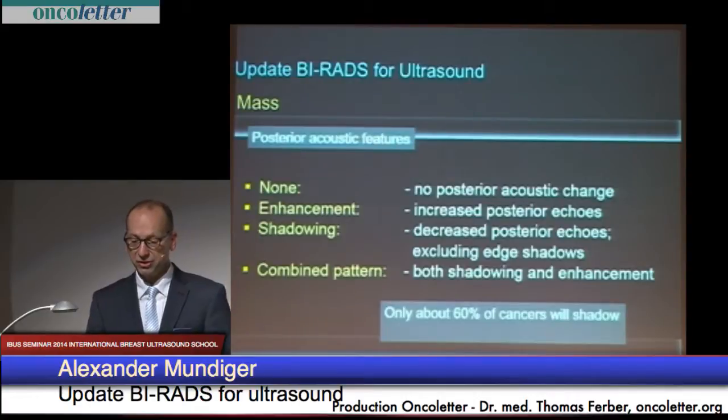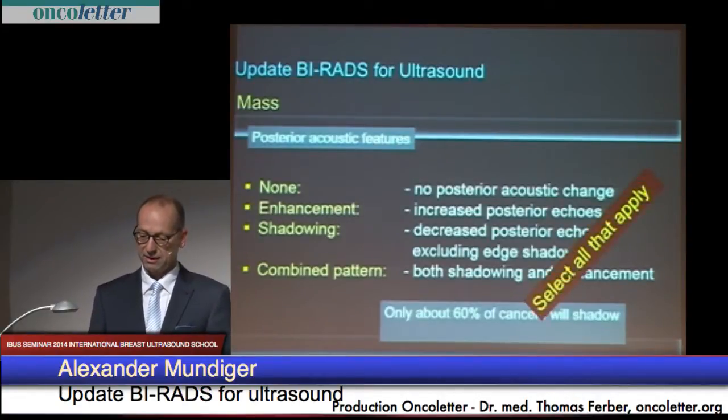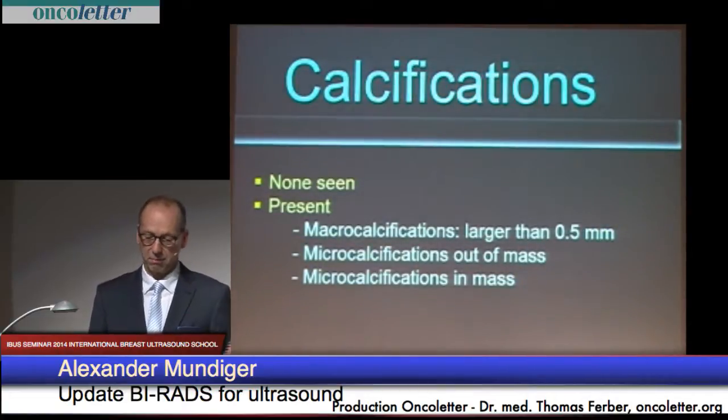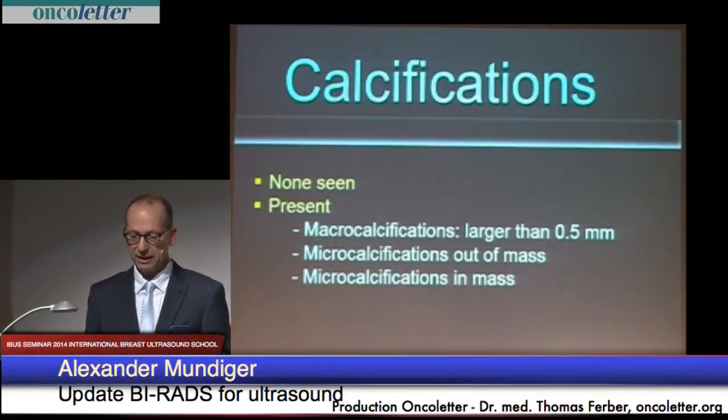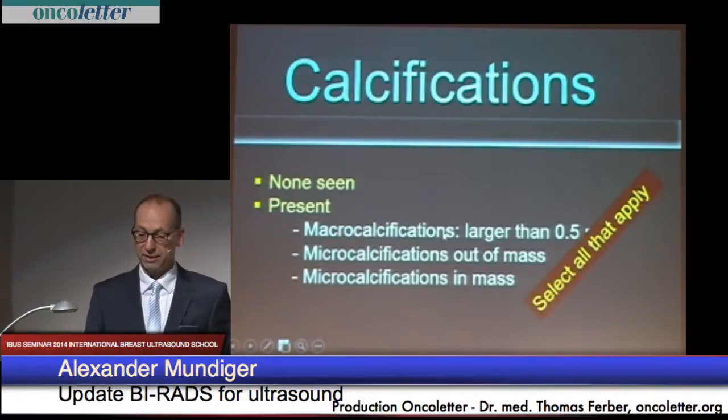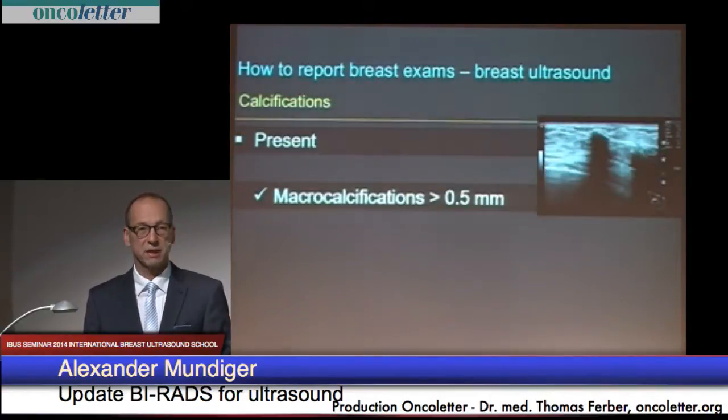posterior acoustic features, and nothing really has changed with these descriptors. Here are some calcifications. In most cases you will not see any calcification, but if they are present, it's a different definition compared to the mammographic statement. And I would like to give you some examples.